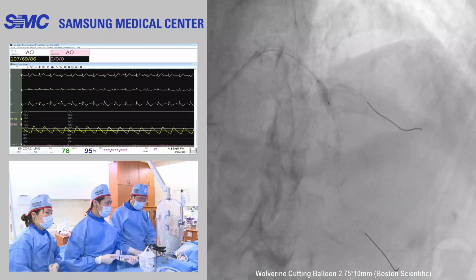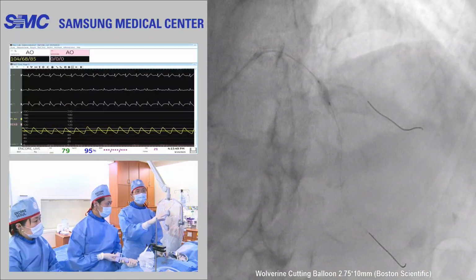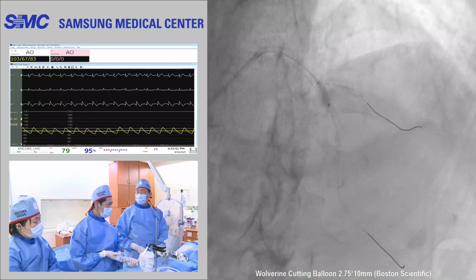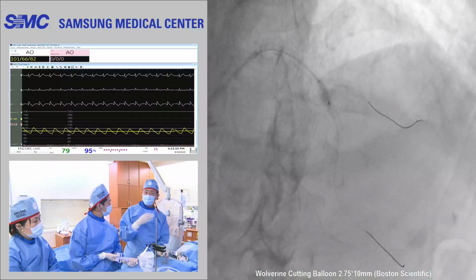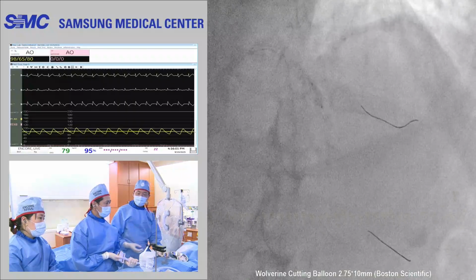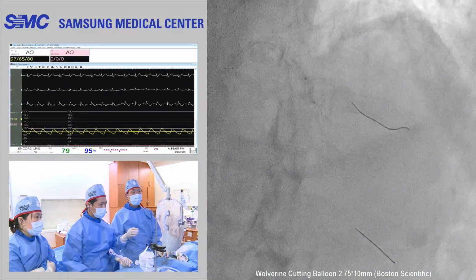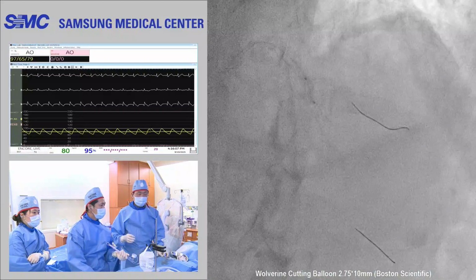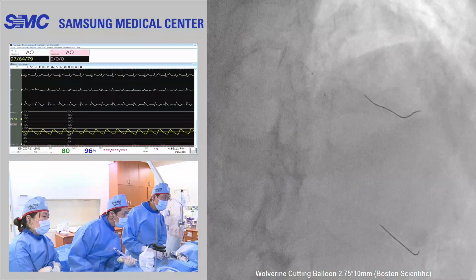This is not really expanded. So actually at the bifurcation, it was not encircling calcium, mostly about 180 degrees. So I expected some expansion of the balloon. Deflation. I tried a very prolonged ballooning. Yeah, pull back a little bit more.